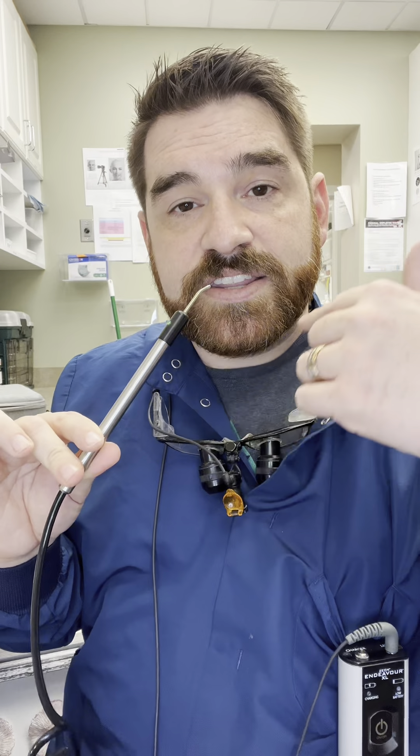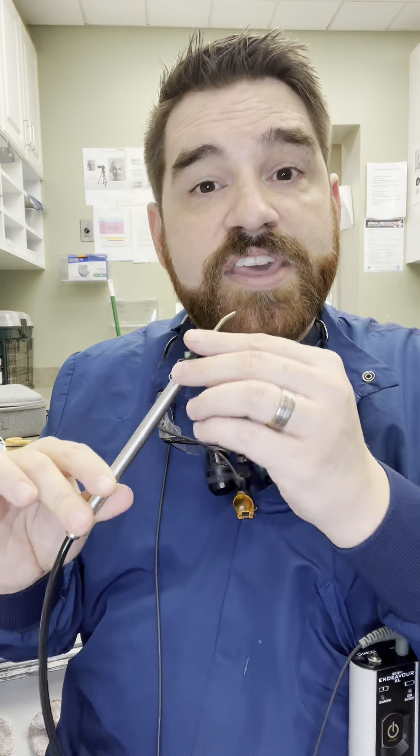Then I have the patient touch anywhere on this probe with a few fingers. We touch this to the tooth and the electricity starts running through and it slowly ramps up. When the patient feels an electrical tingle they just let go of the probe and the tingle stops. If the patient feels a tingle that means the tooth is working. If the patient doesn't feel a tingle, that usually means that the nerve is necrotic and it will need to be removed.